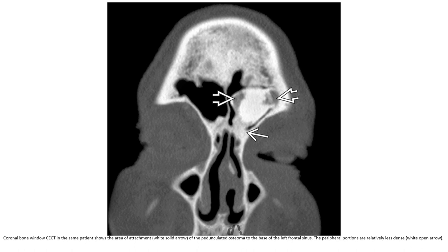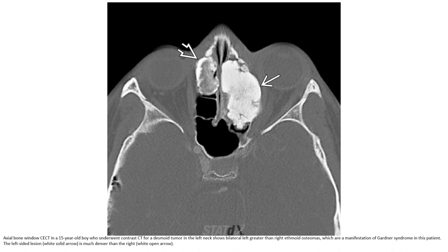The peripheral portion is relatively less dense. Contrast CT in a 15-year-old boy who underwent contrast CT for a soft tissue tumor in the left neck shows bilateral left greater than right ethmoid osteomas, which are manifestations of Gardner's syndrome in this patient. The left-side lesion is much denser than the right.